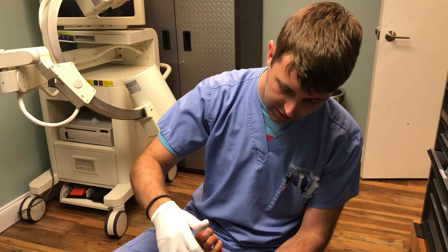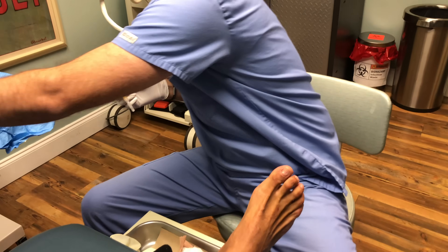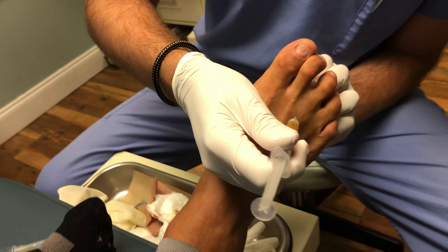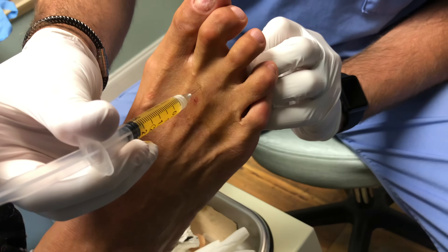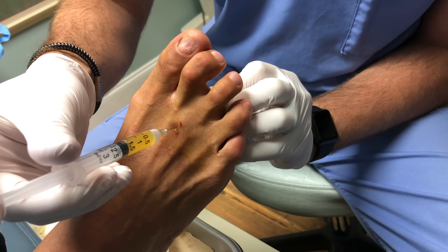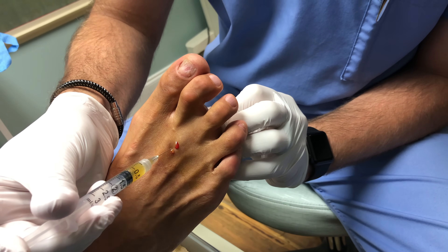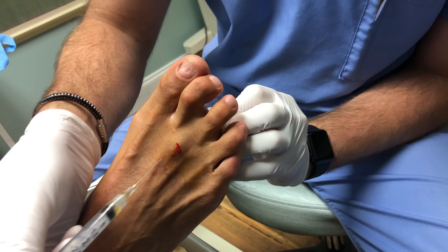So now we're going to do the last part, which is the PRP with the ozone. Don't mind the construction in the background. He's already numb in this area. So we have PRP, ozone, and the other PRP. Basically I'm going to come in from the top here where the nerve is and inject the PRP. I'm going to move it around because it allows for better breakdown and regeneration of the cells — you're not doing it in one spot. Almost done with this — it helps to aid in hopefully knocking his nerve out for good.